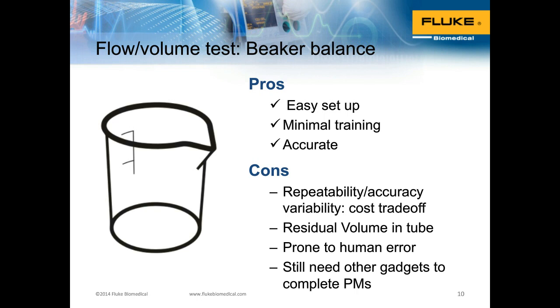So it's a series of events that you have to go through manually to complete that performance characteristic, because you'll have to dial up the pressure gauge and find out at what level the pump is alarming, and whether that ties to the published spec or not. But in both these methods, you'll tend to take a little bit longer, and there's a higher potential for error versus an electronic analyzer.